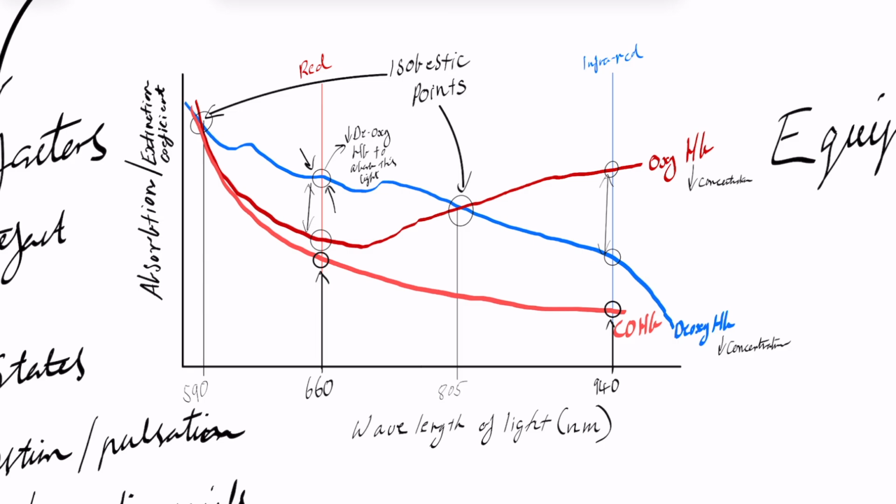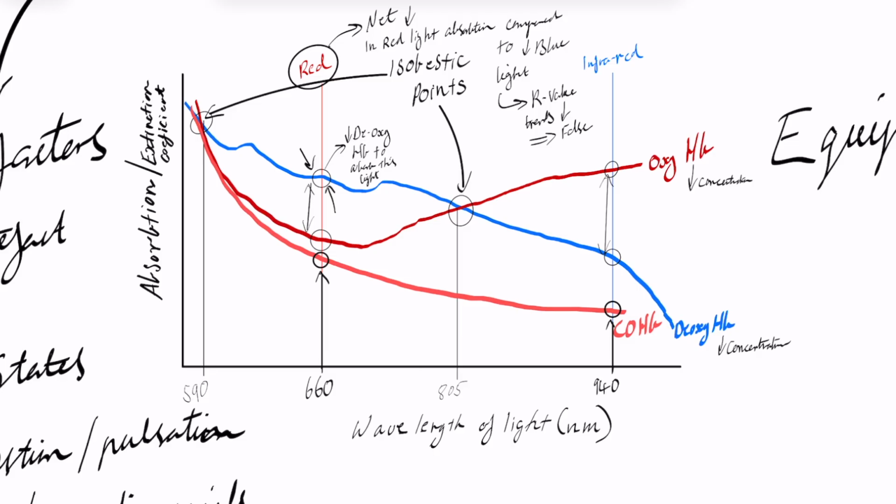However, because deoxyhemoglobin still absorbs red light better than either carboxyhemoglobin or oxyhemoglobin, the reduction in deoxyhemoglobin in the presence of carboxyhemoglobin results in a net effect of decreased red light absorption, and therefore the R ratio is reduced more than predicted, resulting in an SpO2 that overestimates the fractional oxygen hemoglobin content. So because you have a disproportionate loss of your red light absorption, because you've taken away the deoxyhemoglobin that could potentially absorb that red light, it pushes your SpO2 closer to 100, hence why you get a falsely high reading.